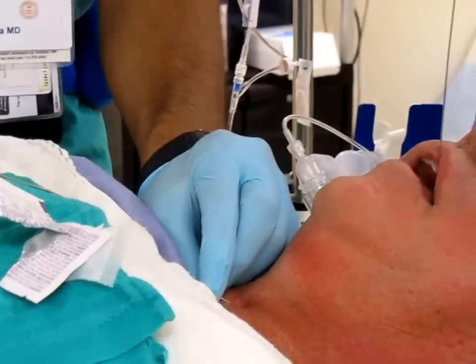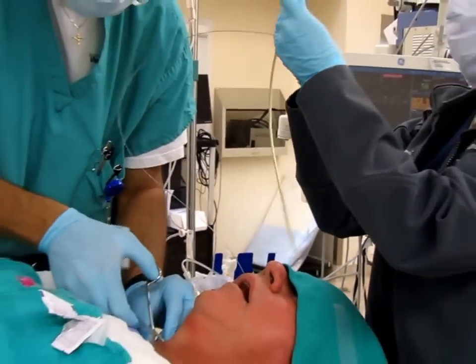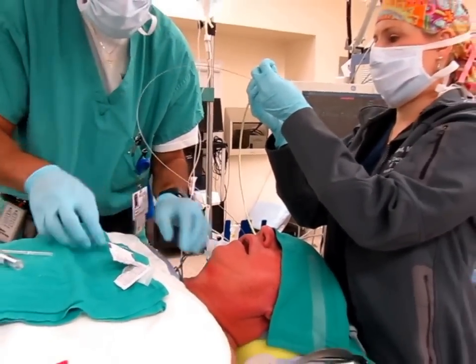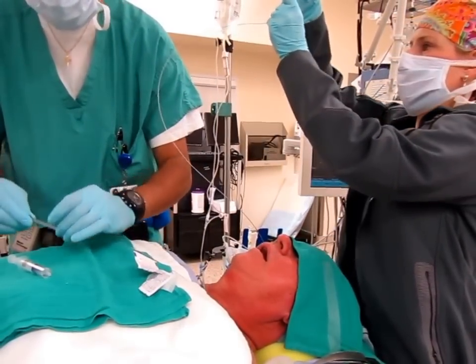Clamp this right at the skin. Take that needle out — that's to avoid moving your guidewire. Now we're just going to put the cook catheter.